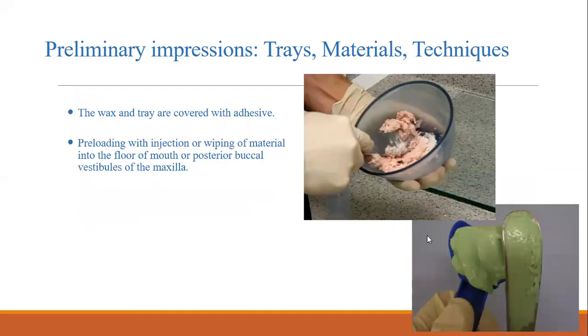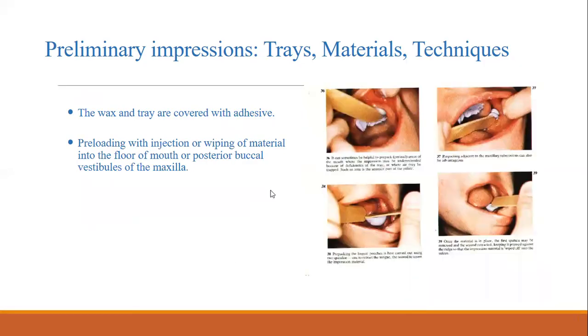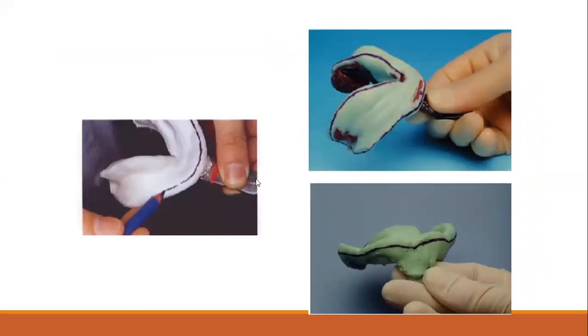هاي الماتيريال أوكي لما بنخلطها it's powder to liquid ratio، بنخلطها بعدين we load it in the tray، بعدين we put it inside the patient mouth. It is advisable لما بدنا ناخذ عند البالت إن أول شيء نحط material جوا عند البالت لأنها رح تطلع لنا void كبيرة، بعدين بندخلها بالتري. Okay, so this is an alginate impression.